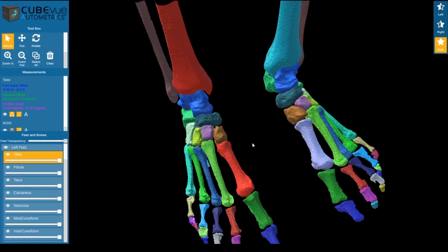With CubeView Automatrix, our goal is really to help relieve some of that cognitive load, some of that tedious processing that your orthopedic surgeons may have to do on a dataset, and give them the information and the measurements they need quickly and easily so that they can really make use of all the information they're getting from these scans.